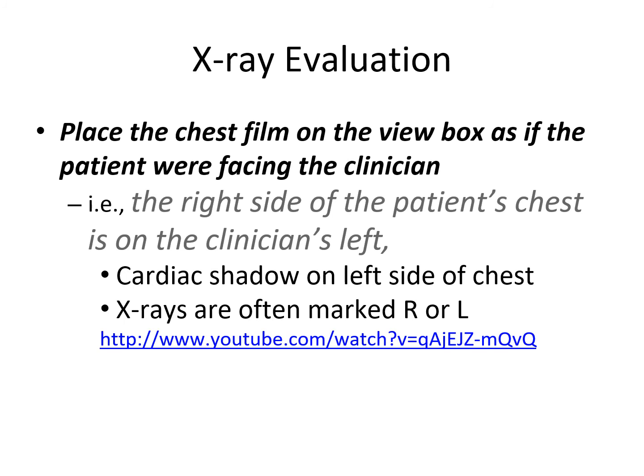There's a lot of information on this one again. So your cardiac shadow is always going to be on the left side. When you're looking at x-rays, you have to get used to it. Usually they have one of the sides marked with an L or an R. Looking at my computer screen right now, the right side of my screen, when I put my right hand up, is really the left side of the patient facing you. So you have to get used to flipping that view around.